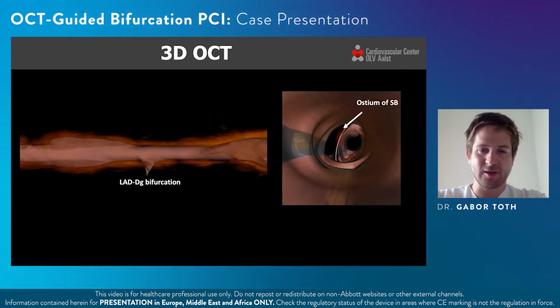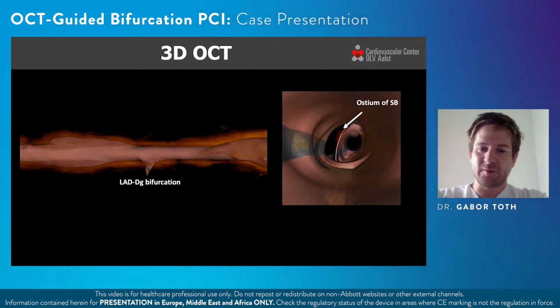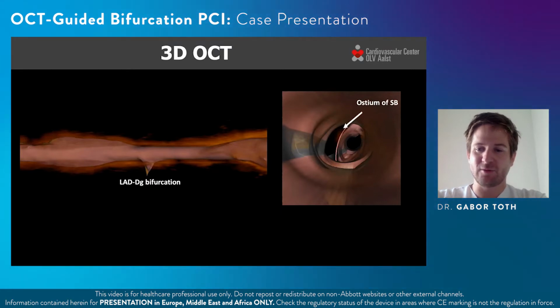It was demonstrated here by Carlos that we don't see much double or triple layer in the proximal main branch, which helps us to exclude more or less DK crush or culotte as the previous technique. So we can assume that it was probably a T with very small or almost no protrusion. For this reason, I believe it was a huge help to see with imaging, as a starting point, to understand the previous anatomy.